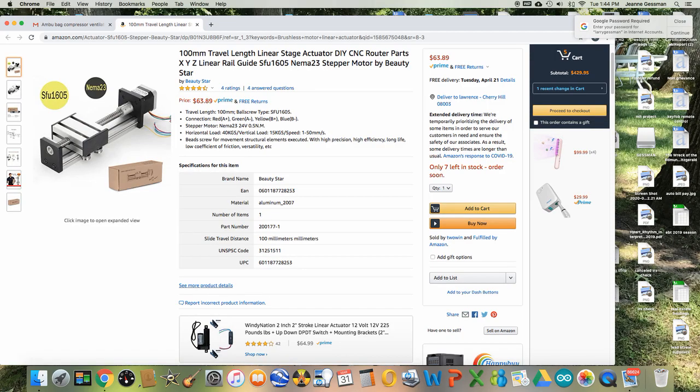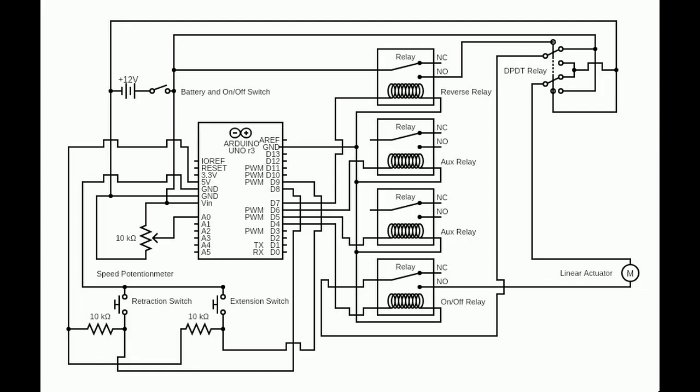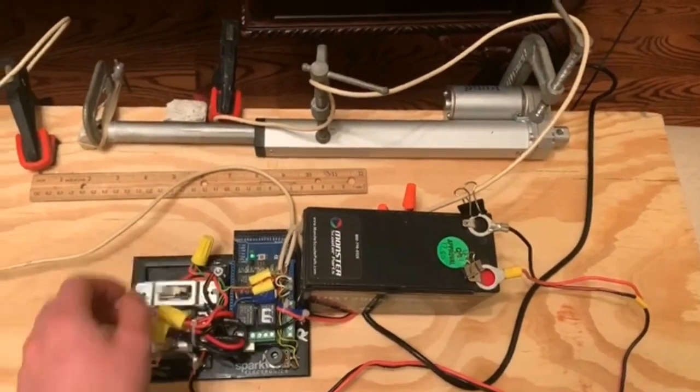The advantage of using an actuator is it is an available part that can just be bought, hopefully in high quantities, and then the ventilator can be easily built around it. Because many of you may try this design, I designed an Arduino control circuit that would be universal for any linear actuator.